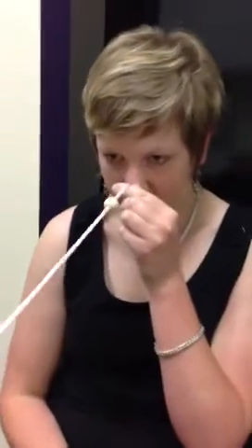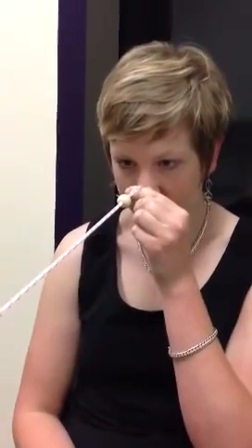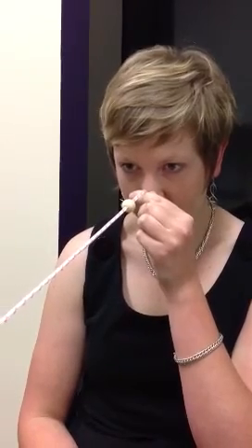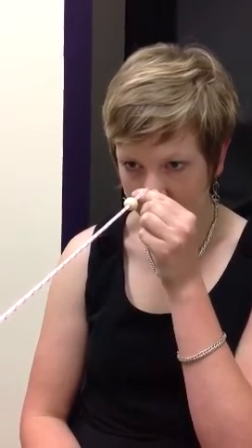Now jump to the green bead. Hold it. Still crossing at the bead? And jump back to the one closest to you. Now back to the green one, back to the white one, back to the green one. Good.